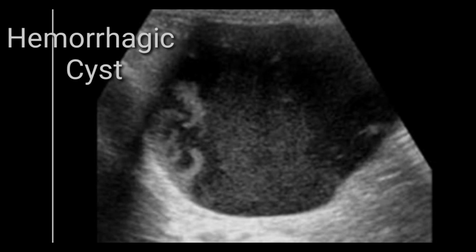So if you come across a hemorrhagic cyst or any complex cyst and your suspicion is towards endometrioma or chocolate cyst or dermoid cyst or cystadenoma or cystadenocarcinoma, these are the likely differentials or likely possibilities. So advise an MRI scan, because the MRI scan will explain all these things in a beautiful way. So this is the hemorrhagic cyst example.